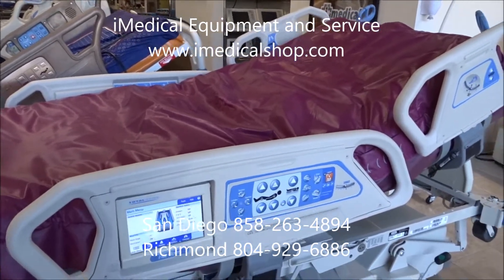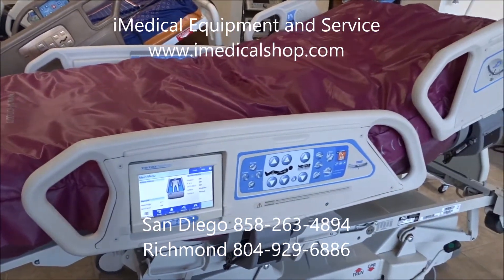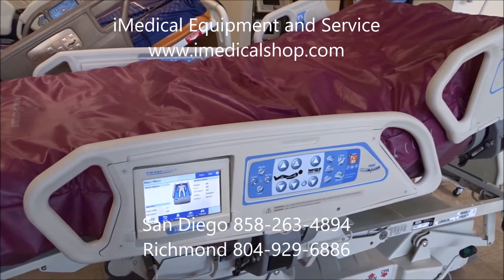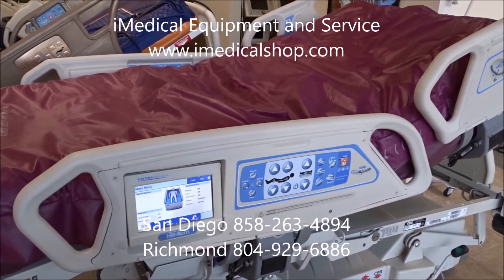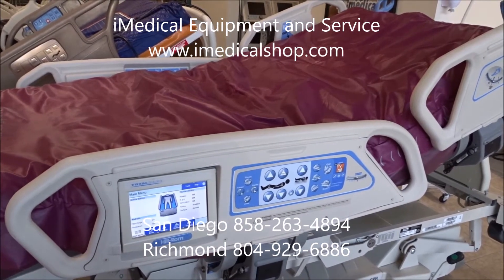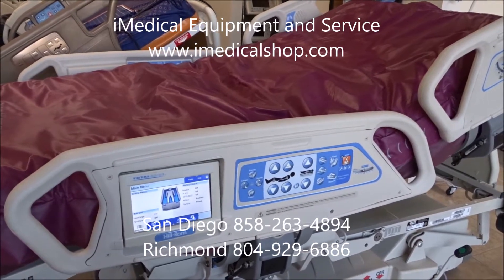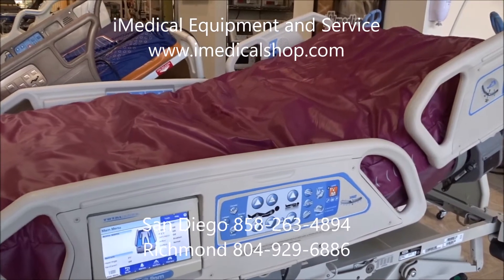We're at iMedical Equipment and Service, looking at the Hillrom P1900 Total Care Sport 2 Hospital Bed. We're doing a quick series of training videos with this particular bed. We just did one on percussion vibration, which is a pulmonary feature that helps break up the mucus and congestion in the lungs. And now we're going to look at the lateral rotation, which is the auto-turning and auto-patient turning system.